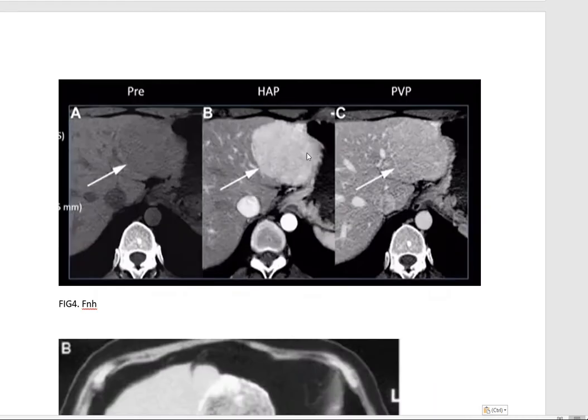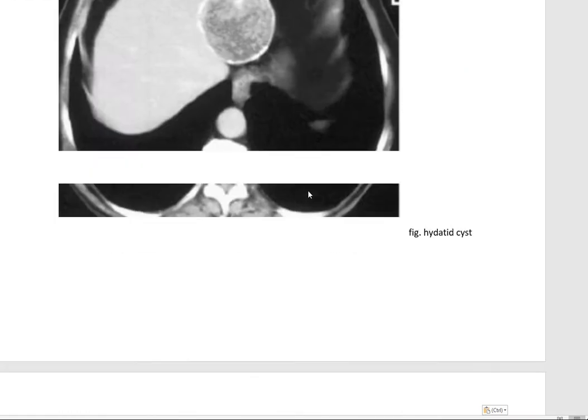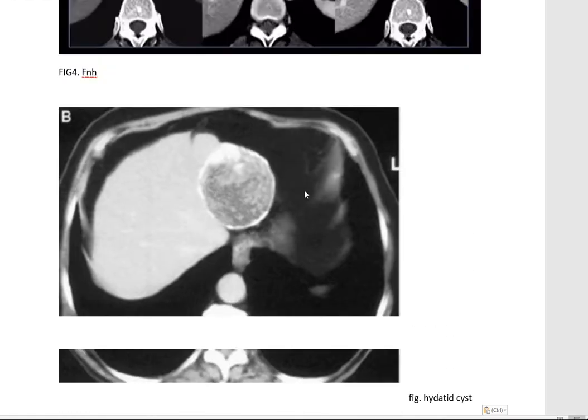And for FNH, it is whole uniform enhancement — compared to the peripheral enhancement seen in adenoma. Now we are going to talk about hydatid cysts.